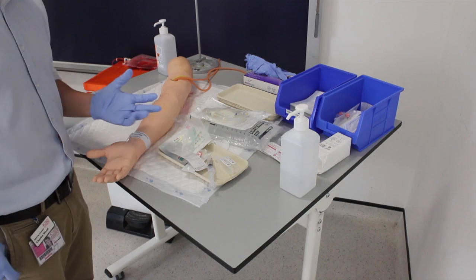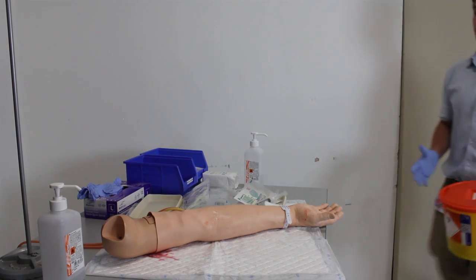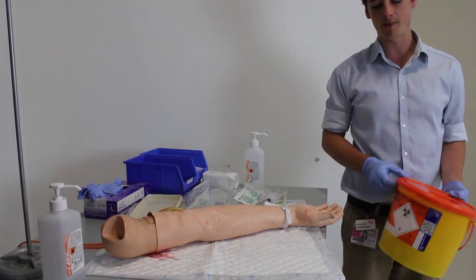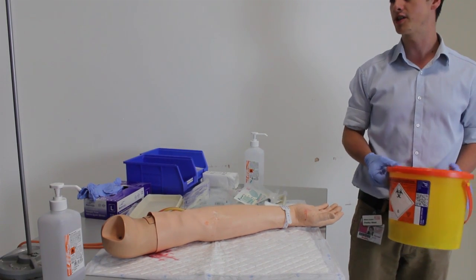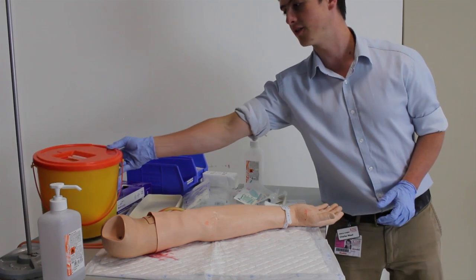Now that my equipment's ready, it's time to approach the patient. When you're approaching the clinical area, it's important to make sure that you've brought a sharps bin with you so that you can safely dispose of any needles used during the procedure. Just place that down on a flat surface near the patient.